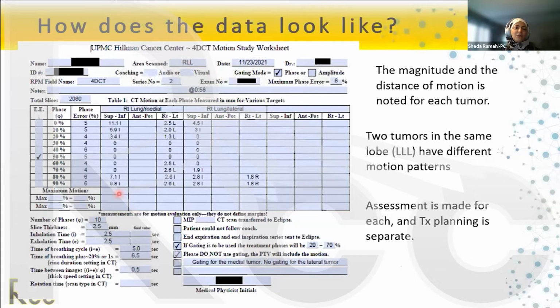It is when the tumor is moving more than 5 millimeters that we have to exclude these phases from the ITV, from the planning. And as I said, you should expect that the phases around maximum inhale are the phases with the largest motion of tumor.